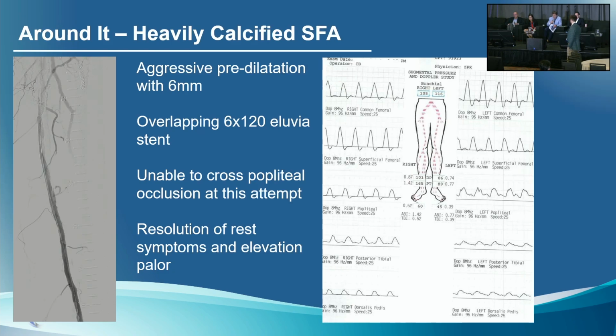You can do whatever you have to do, whether it's IVL, subintimal, or more aggressive, or paving crack, whatever you need to do. But I think the failure mechanism here is going to be what you see at 30. It's going to be hard to expand a nitinol stent fully against aggressive calcium. And this is why it's an indication to consider an interwoven stent. That's a great point, especially on the last talks.